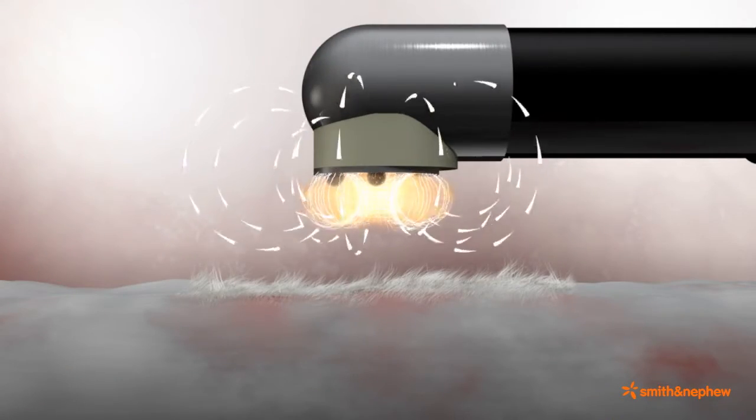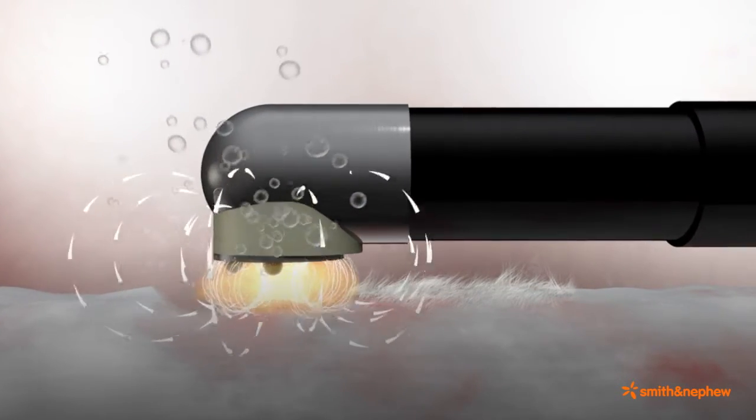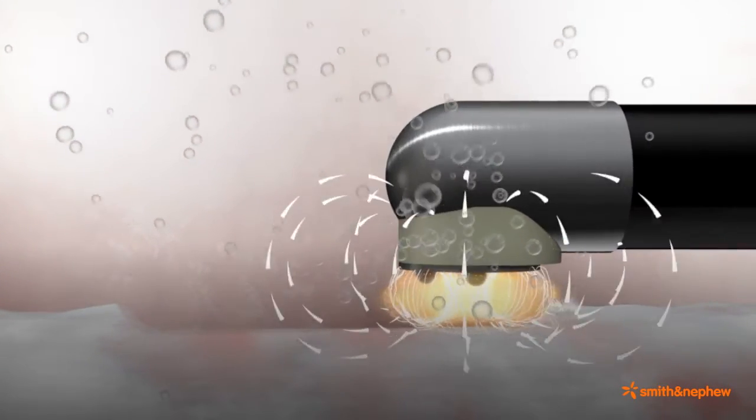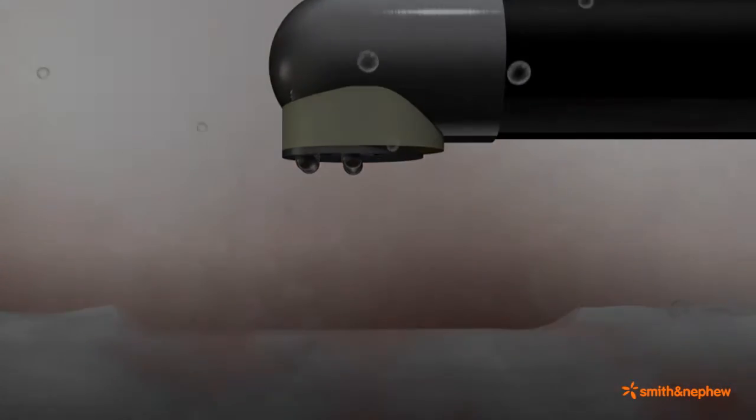The energized particles in this focused plasma layer have sufficient energy to disintegrate organic bonds within targeted tissue, removing one cell layer at a time. The result is volumetric tissue removal.